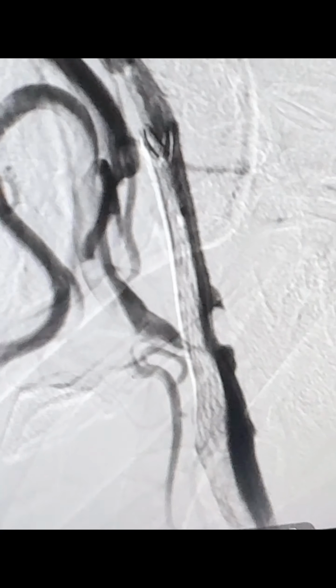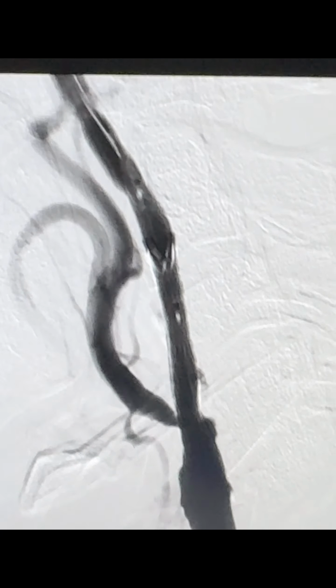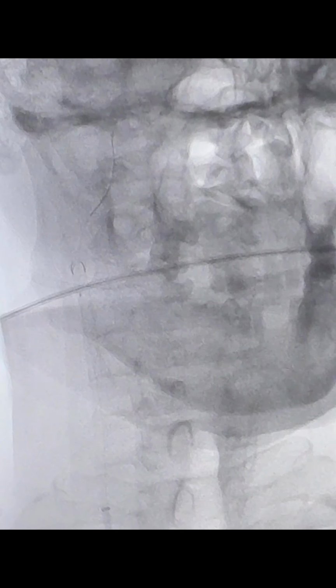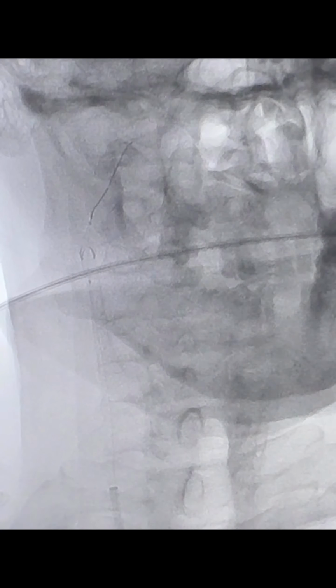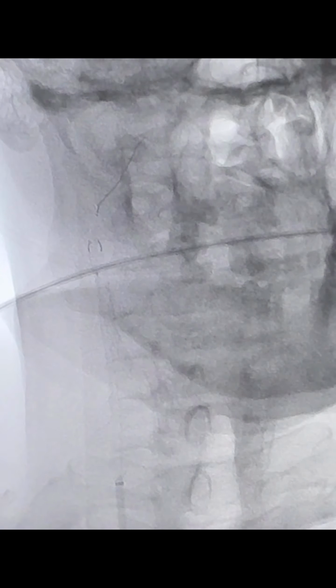Now we are waiting for 10 to 15 minutes. We are taking multiple shots through the stent. We are seeing that the entire plaque is covered with the stent. We wait for 15 minutes, and after that we take a check shot which shows there is no thrombosis and there is good flow across the stent to the intracranial circulation.